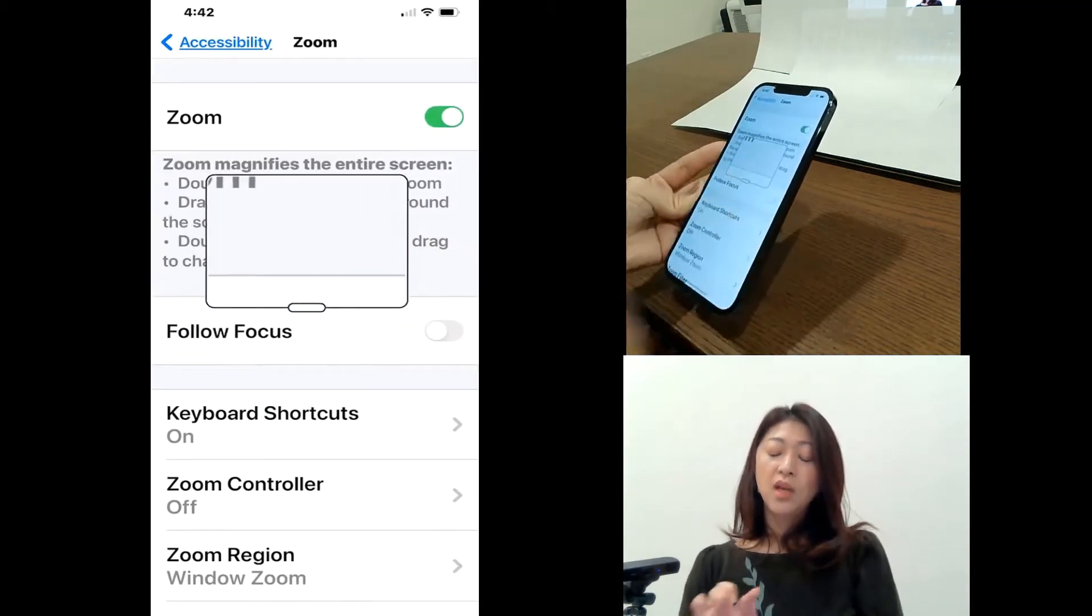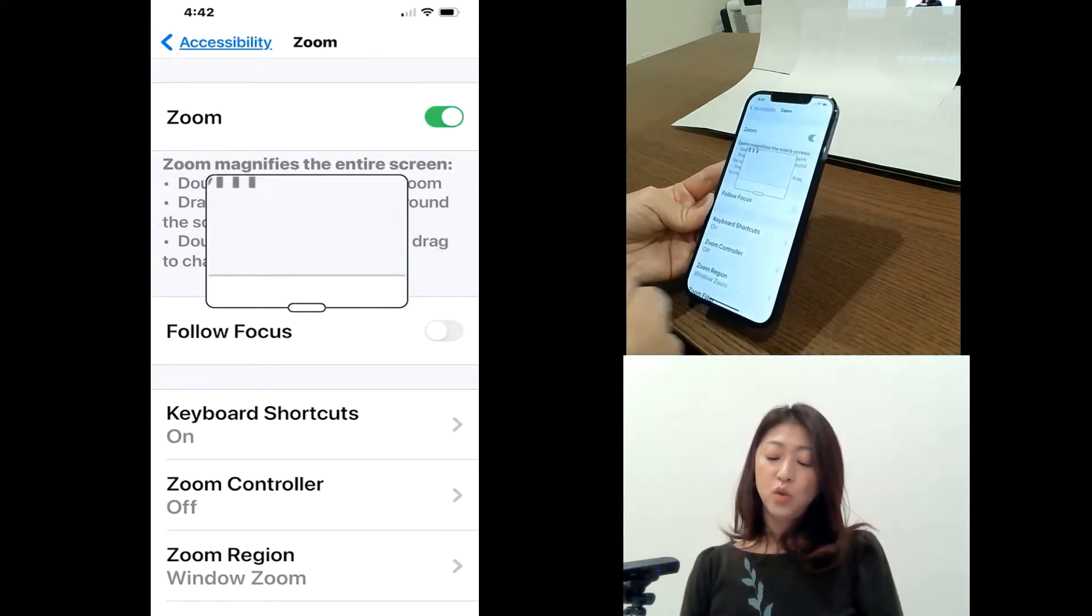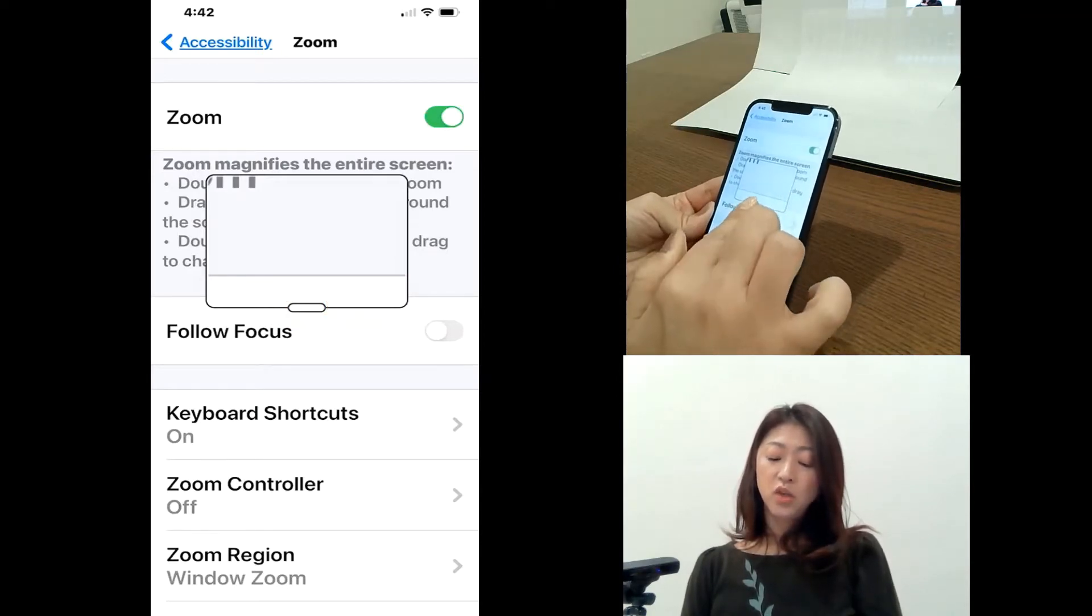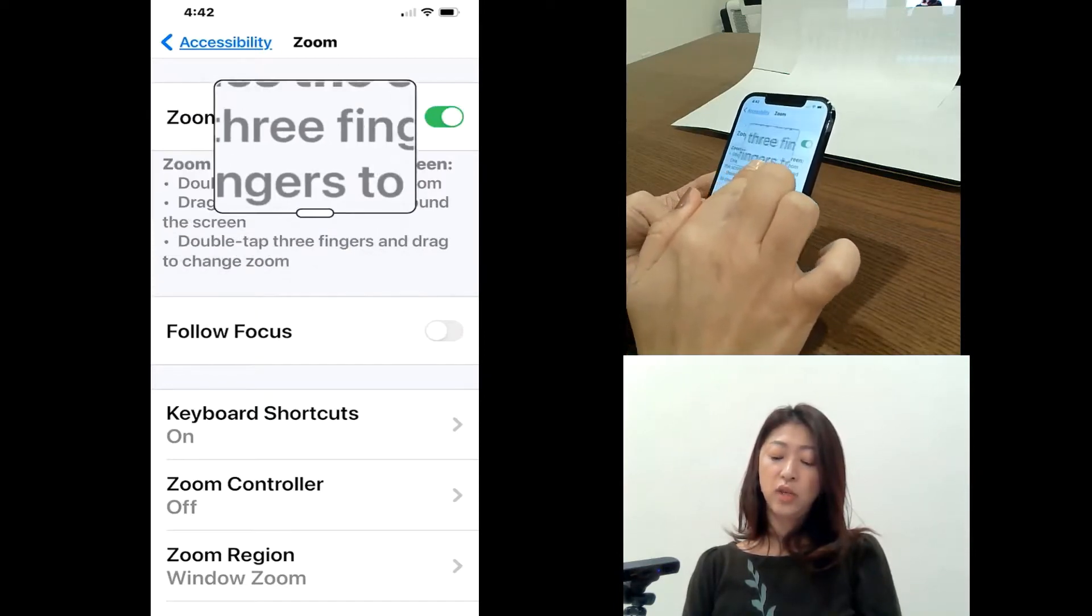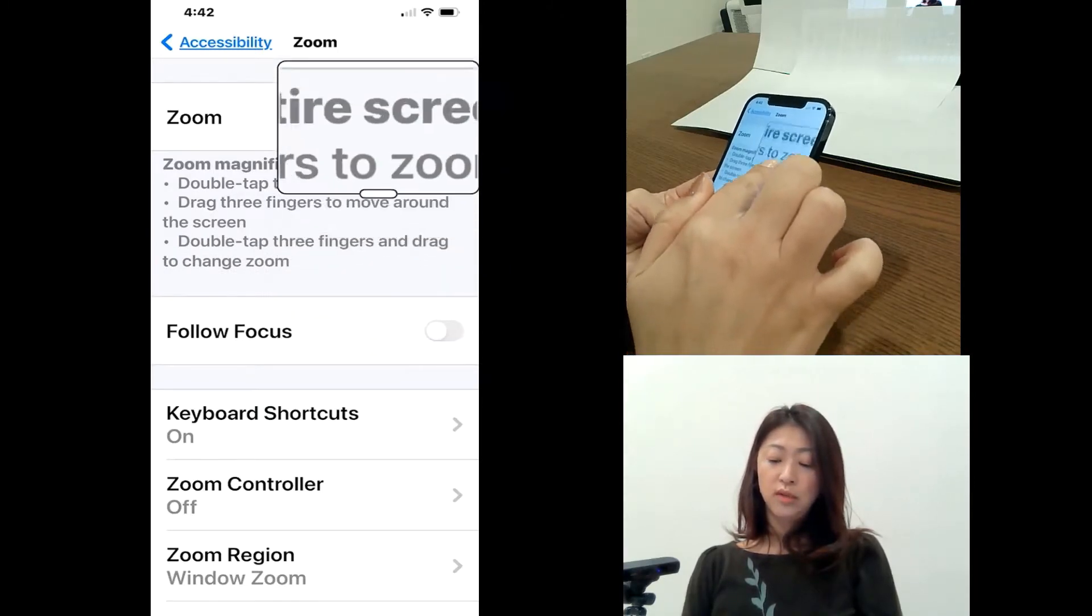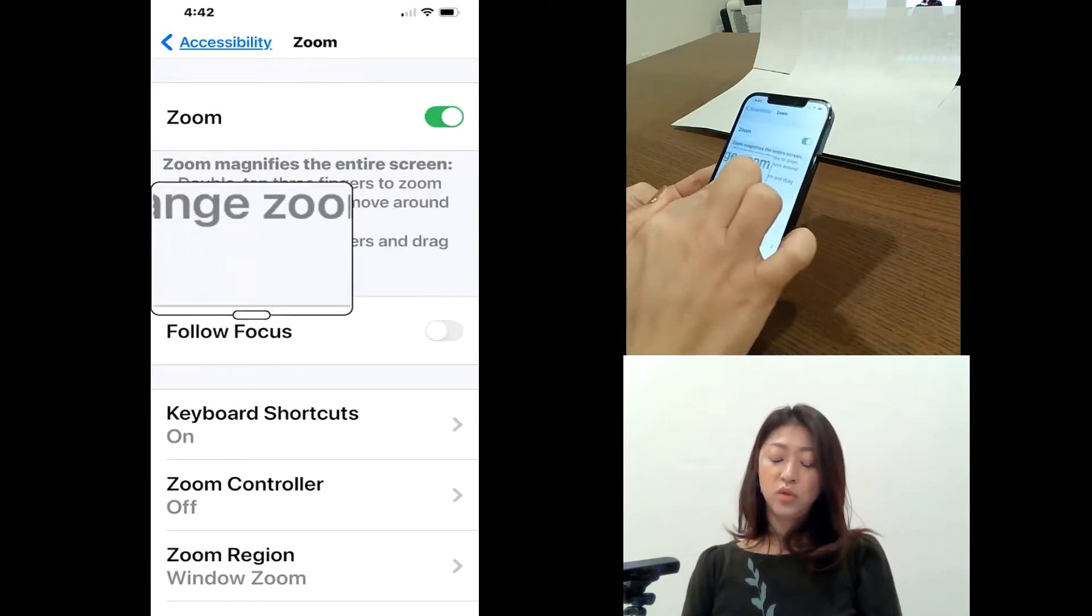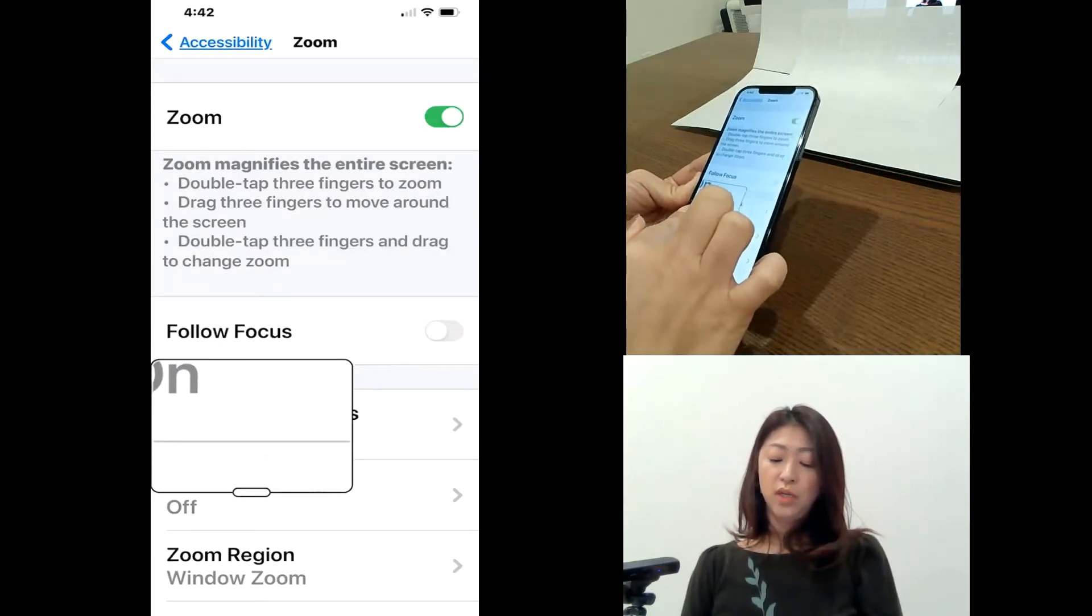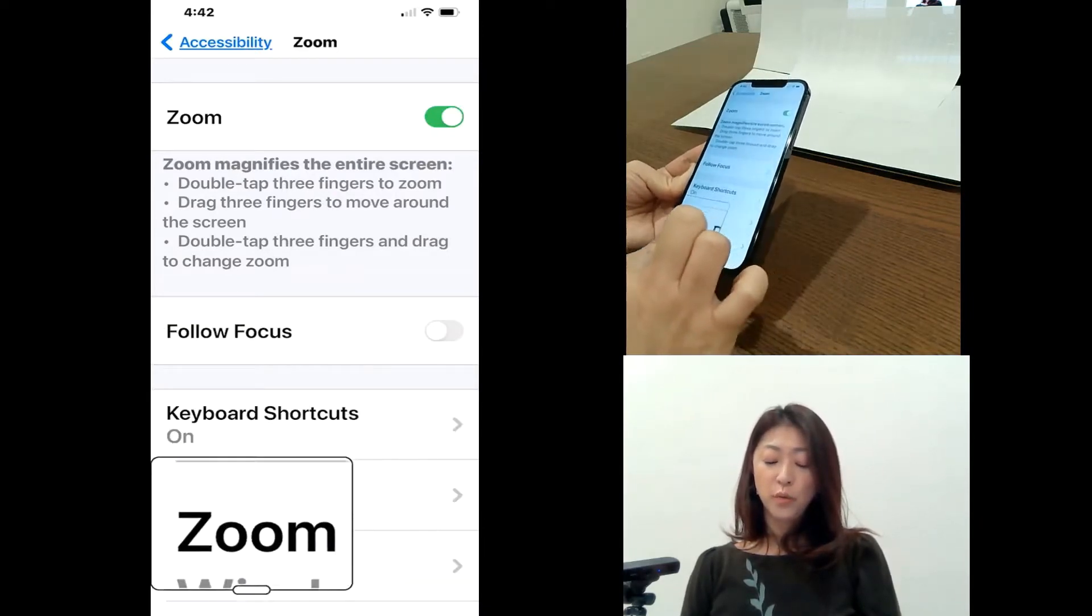So when you get this zoom window, you see there is a handle. So place your finger on the handle of the zoom window, and then you can move it around on your screen to see what's on your screen with zoom window.